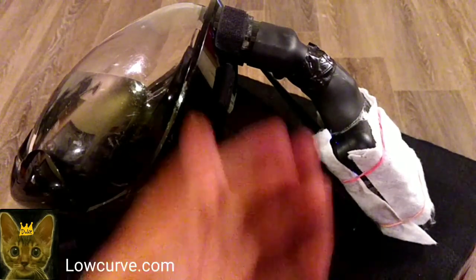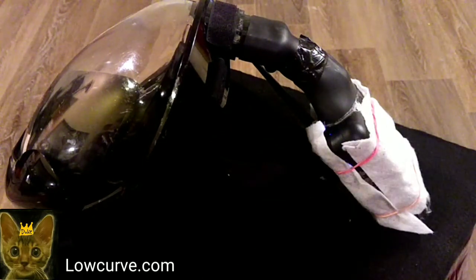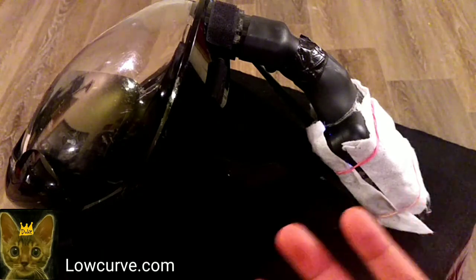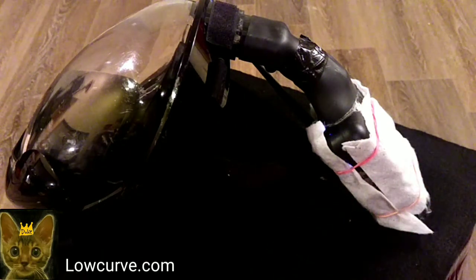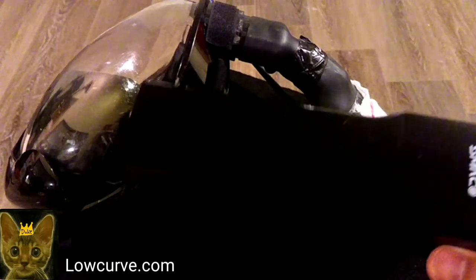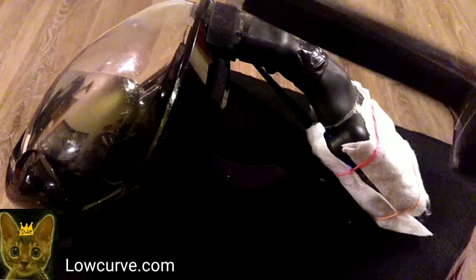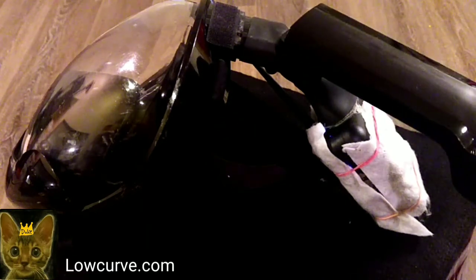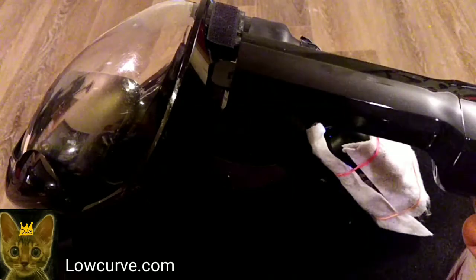But you'll notice that it's not modular anymore because it's kind of permanent. The reason why I have it like this is to continue the theme where in all these tutorials, everything I do doesn't require very many tools. So if you do have tools, you can actually use the original snorkel that's provided.